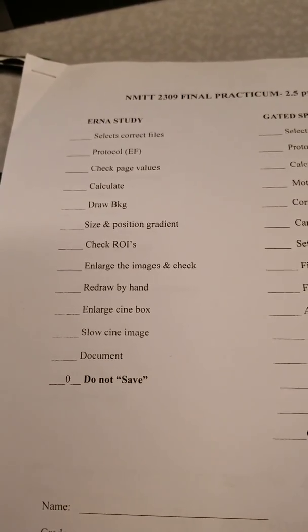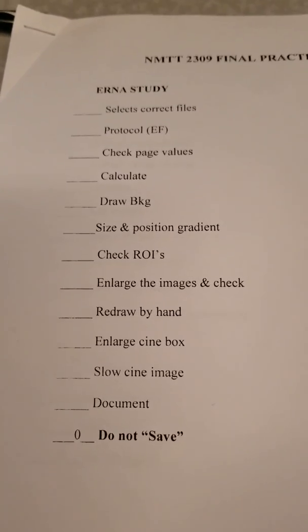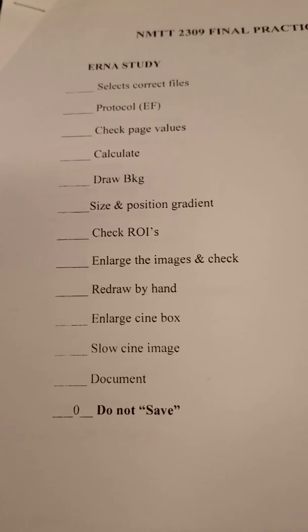Nuke Tech Methodology, Final Practicum, MUGA Study, ERNA. This is the grading rubric, all of the things that you have to go through in order to get your A.